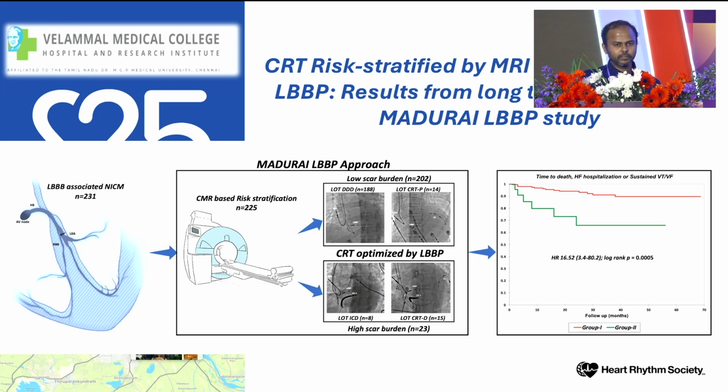at the end of 2 years. On the other hand, those patients with a high scar burden, as expected, had a lot of clinical events in terms of arrhythmias and mortalities during follow-up as compared to those patients with a low scar burden. So here comes the importance of risk categorizing them and providing them a cost-effective CRT, because we are living in India where finances are big restraints. Not all patients can get a CRTD box. Some of them may not afford even a simple dual chamber pacemaker.